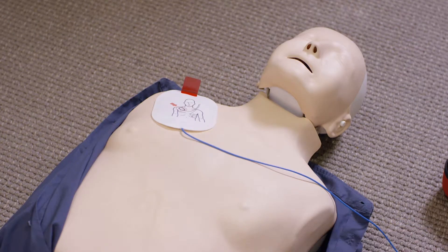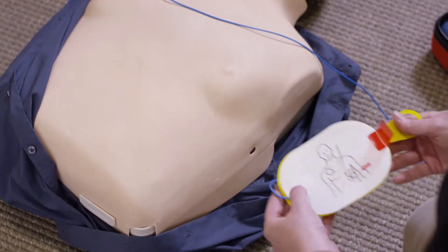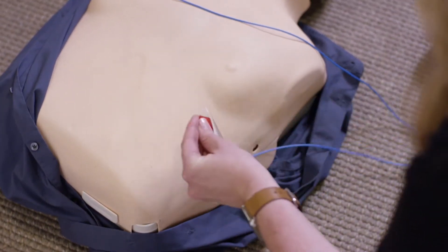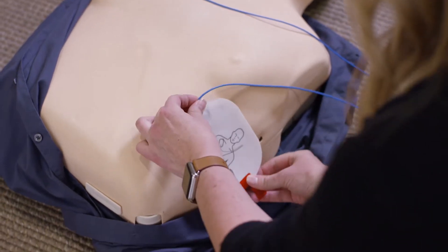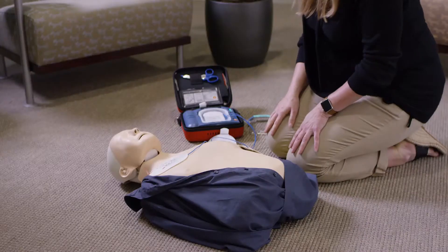The OnSite itself walks you through the entire rescue process and lets you do it at your own pace. Once the pads are on the victim, the system will analyze the victim's heart rhythm and tell you when to deliver a shock — if and only if the victim actually needs it.